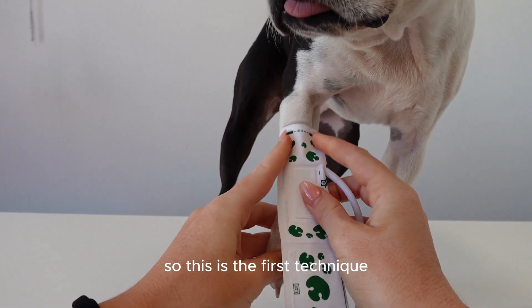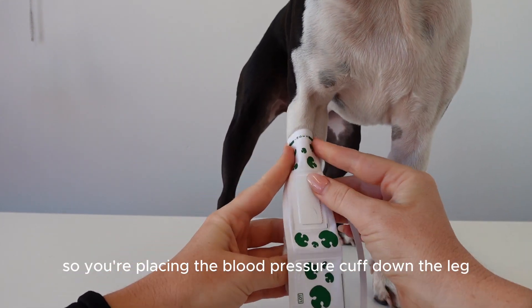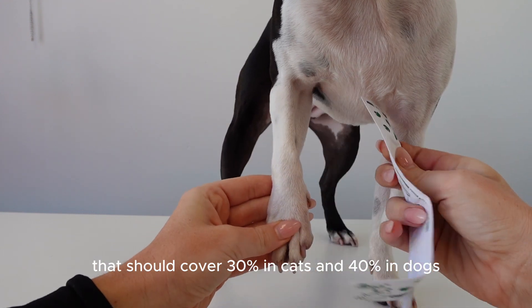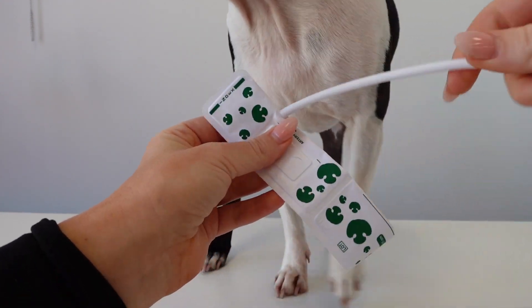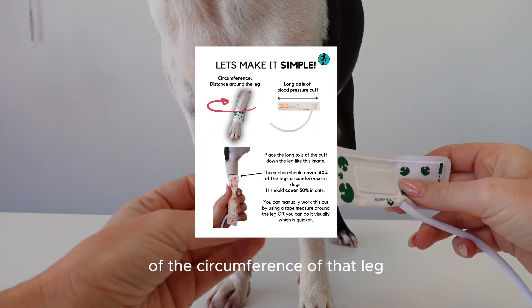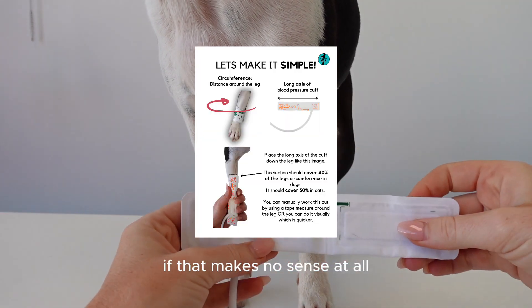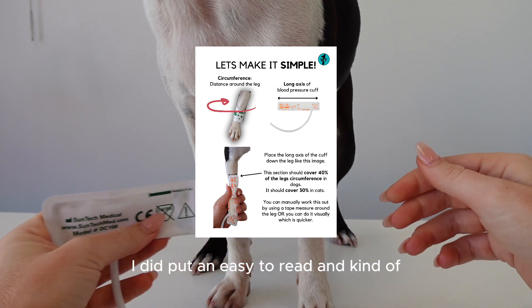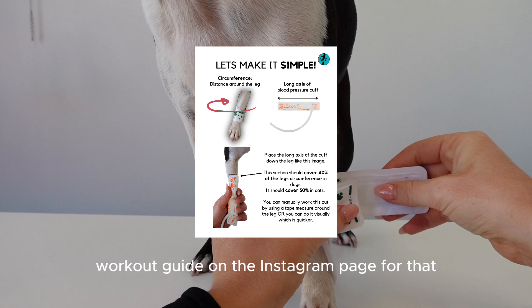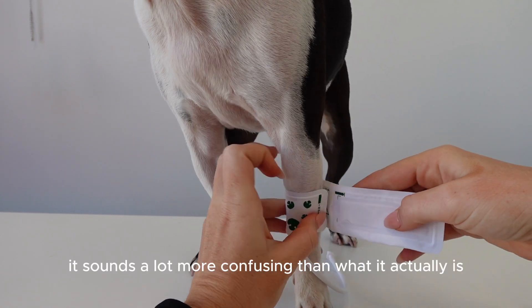The first technique is placing the blood pressure cuff down the leg — the part across the top should cover 30% in cats and 40% in dogs of the circumference of that leg. If that sounds confusing, check out our Instagram where I posted an easy-to-read workout guide for it, because I know it sounds more complicated than it actually is.